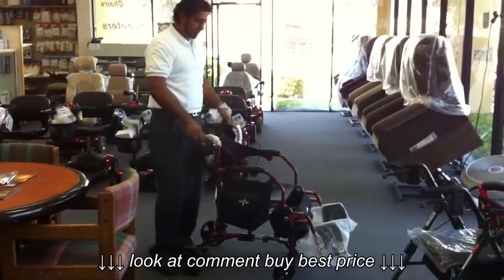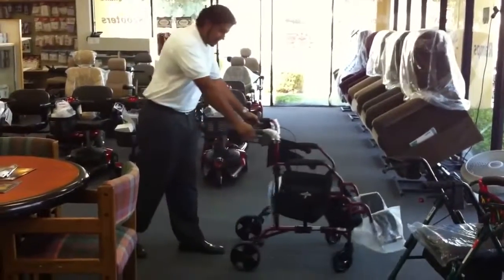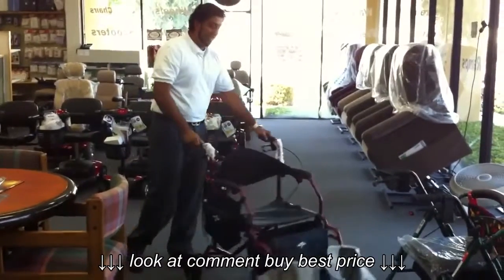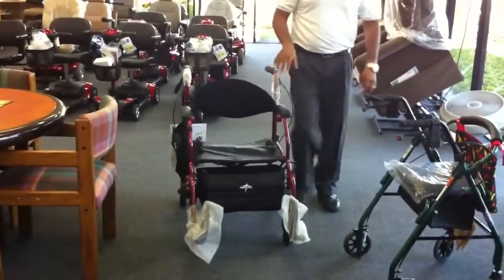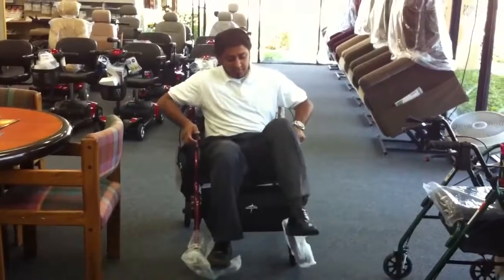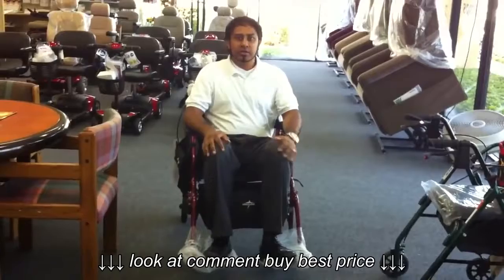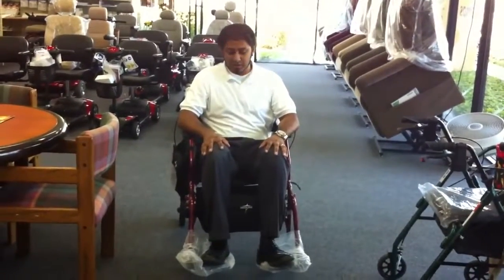The handle height is adjustable for taller users who are pushing. You still have all the functions of the rollator, which is the lock and brake mechanism. But the main difference is that the seat itself is most like a traditional transport chair. Right now the legs are a little low, but we can extend that out to make it for longer patients, or add a cushion for a little bit more comfort.